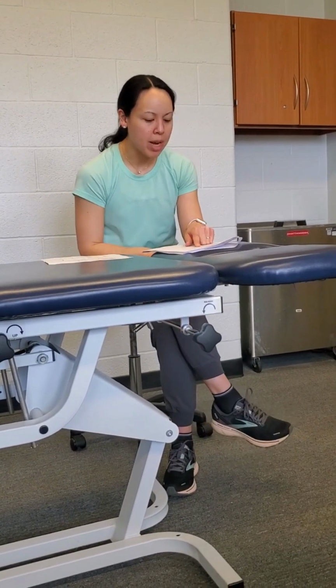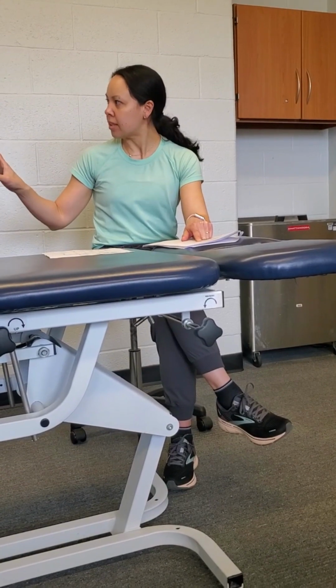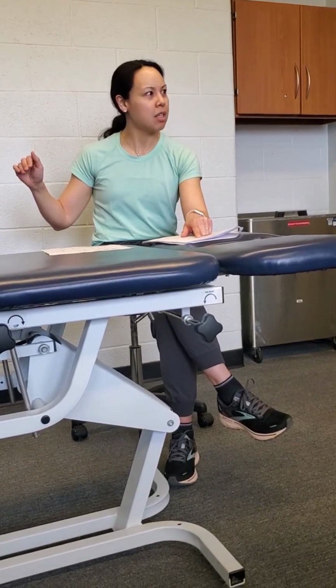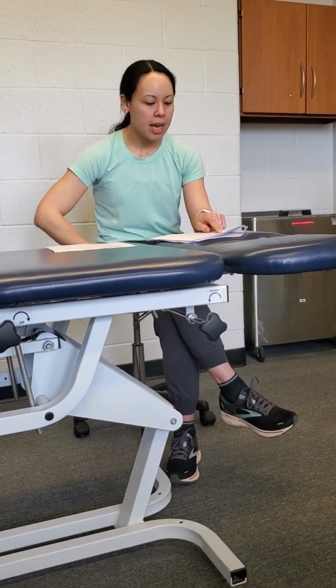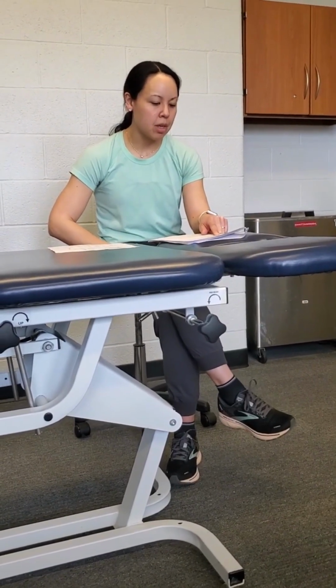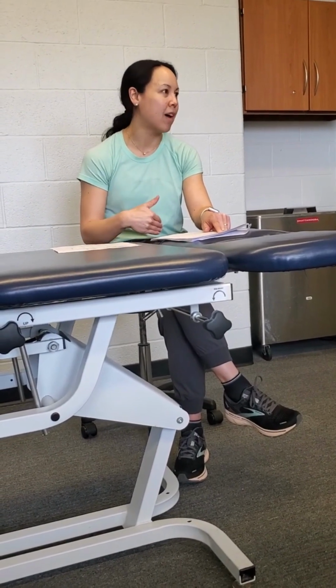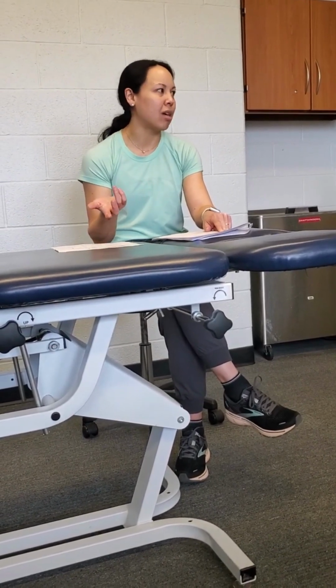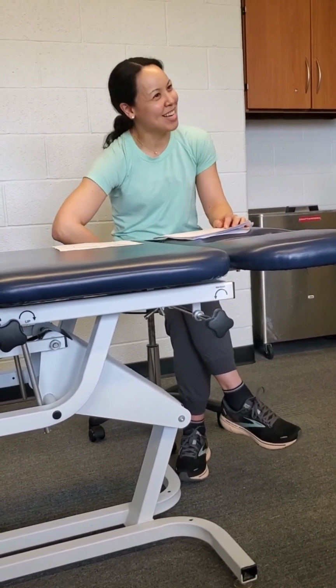Typical treatment time for one exercise is about 6 minutes. I think this is preset for 6 to 8 minutes for each exercise, so it makes it really user friendly. And typically the number of exercises you're going to do in a typical session shouldn't exceed 5. With our 30-minute treatment sessions, I don't think we would be able to even do more than that. So that's fine. Not have to worry about that.